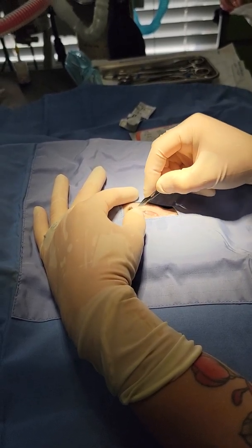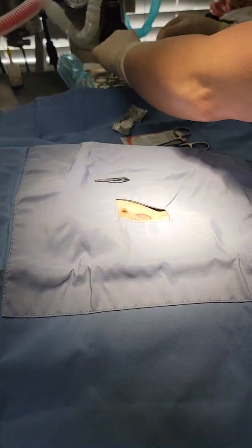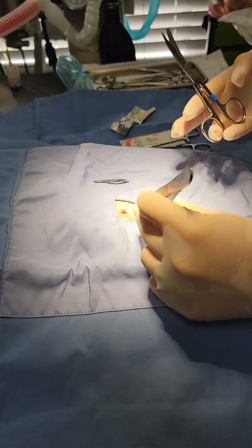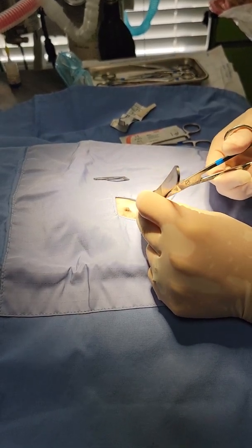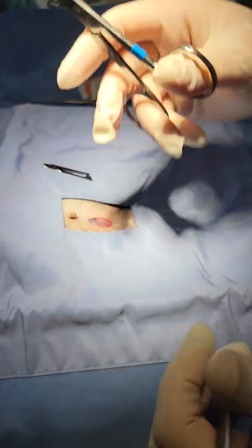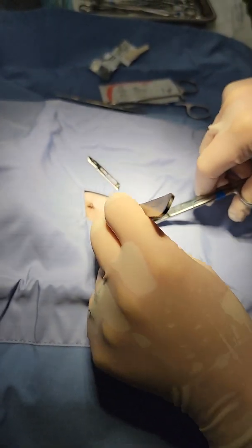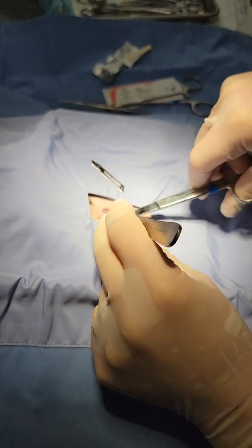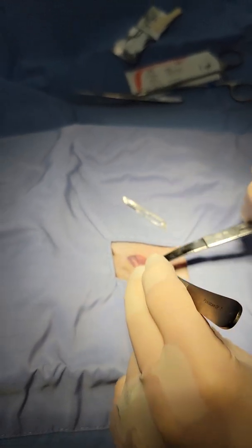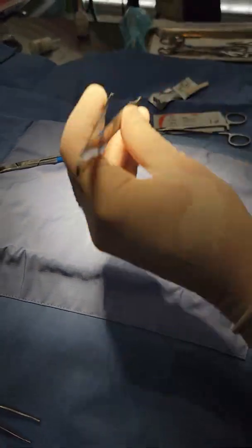So if you need to have them a little bit higher, you can. I make my incision probably about in the region of two centimeters or so, then going to dissect off some sub-Q. And then here's my body wall. You'll notice he's a little bit rotated towards this side, so I'm going to have Jason, my assistant, kind of lift him up to get him back on midline. You're going to look for the linea, which is right there — it's kind of faint, not super well-formed in these guys in the caudal ventral abdomen. So I'm actually going to use rat tooth to pick up the linea.